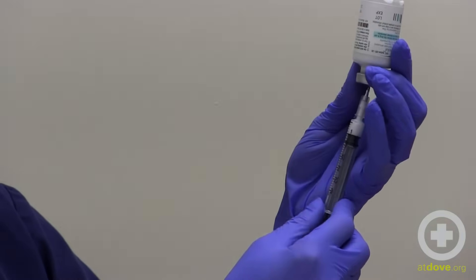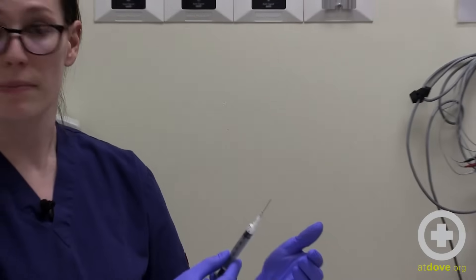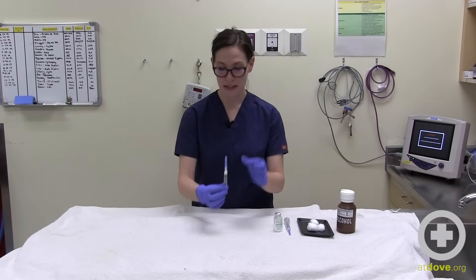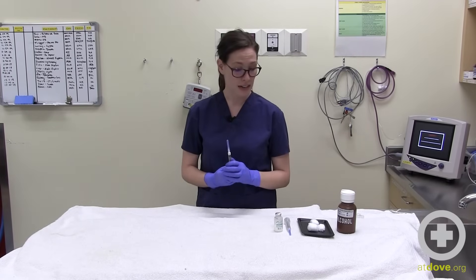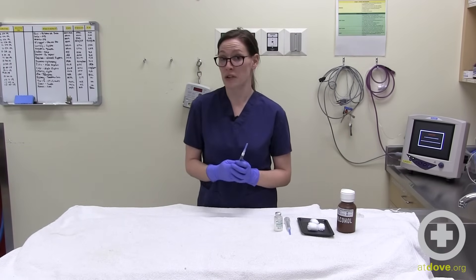And then when you are done, you'll hold your syringe and pull directly out. If you are going to be giving that to a patient right away, you can go ahead and do that. If not, you very carefully recap your syringe by doing the scoop technique so that you don't poke yourself through the sides, and then you're ready to give your injection. And that is how you draw up an injectable medication — that's the very basics.